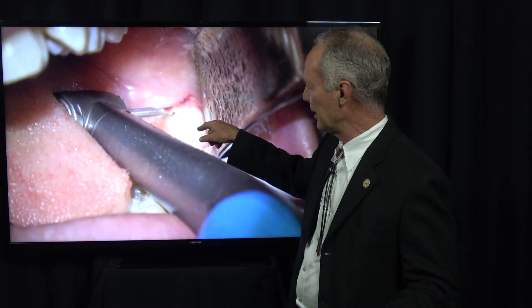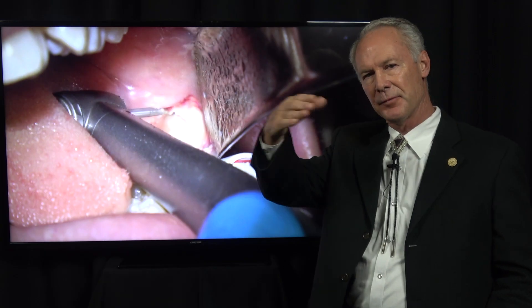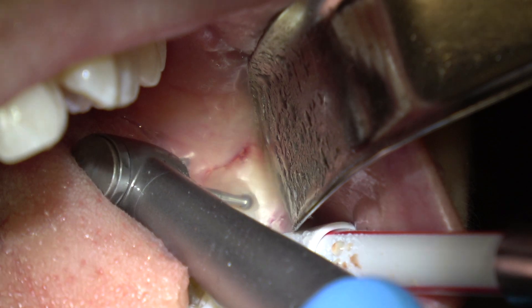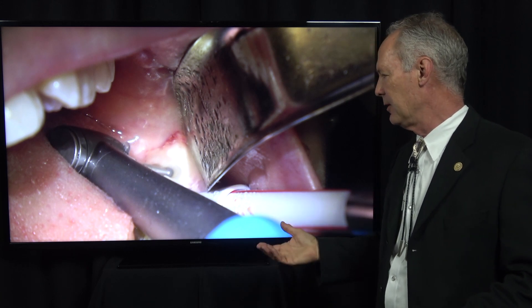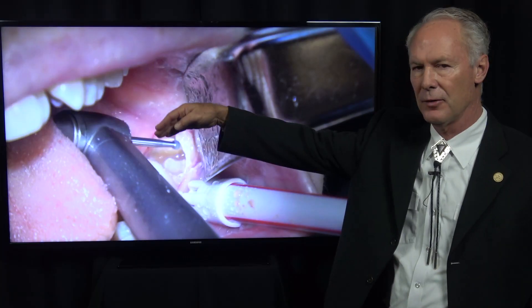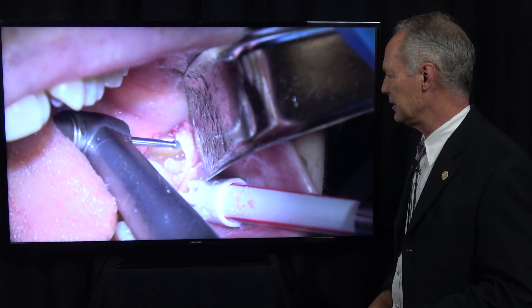On the distal of the tooth, I'm trying to cut the distal of the tooth primarily and not the bone, because I'm losing the tooth anyway — I'd rather not cut that distal bone. I'm sectioning through the tooth from the occlusal surface to the furcation. This is a long shank number four surgical bur. Be careful not to go lingually past the lingual plate — stay in the tooth. I'm not sectioning all the way through lingually because I don't want to risk damaging the lingual nerve.